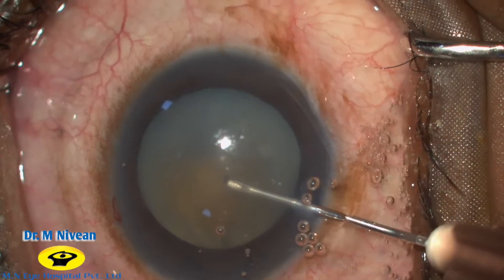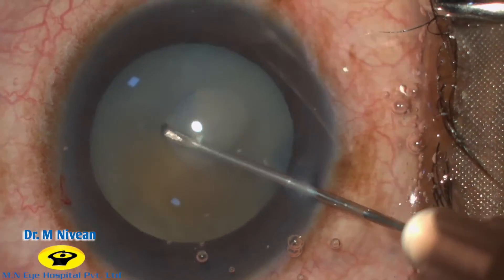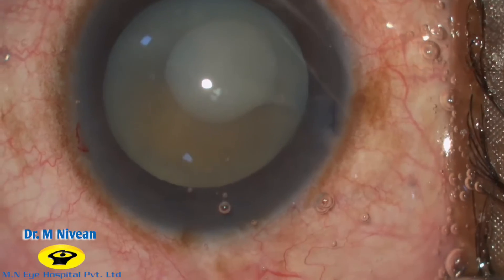Using a bent cystitome needle, a puncture is made in the anterior capsule. You can see the milky white cortical fluid erupting out into the anterior chamber.